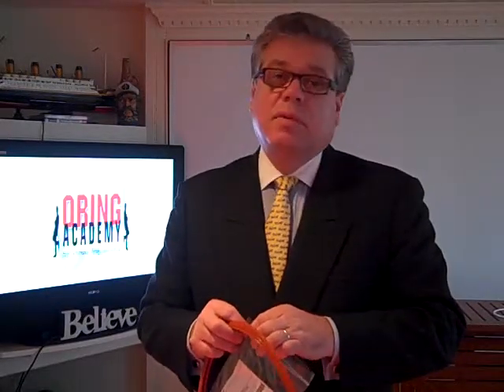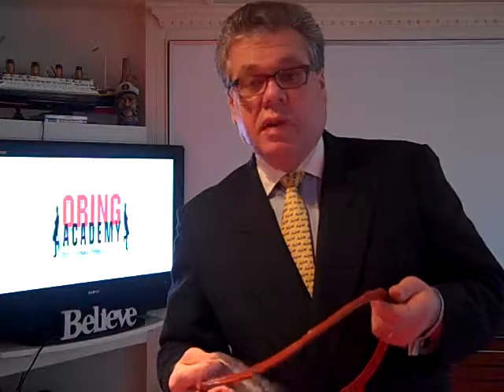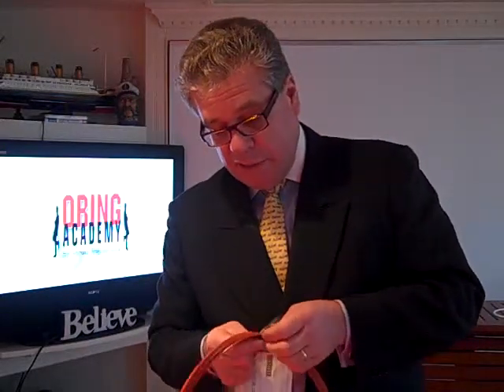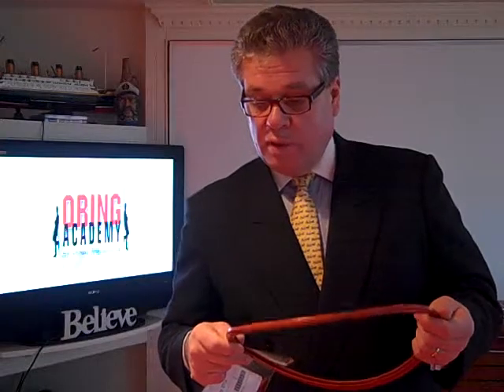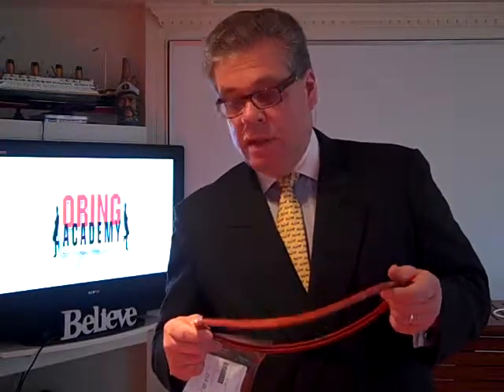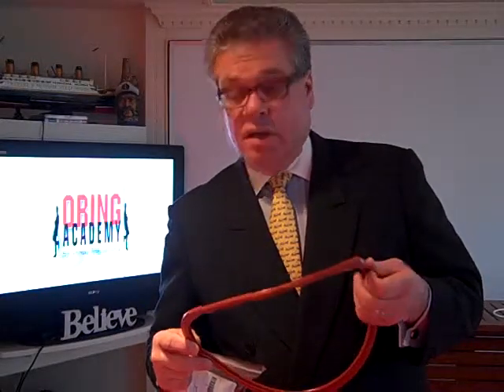Pressure is the big problem with sterilizers. Once you lose the pressure capability, you're not going to sterilize your instruments. I recommend replacing the gasket every six months, because I've seen what happens after you open and close the door many times a day over a period of time — you do lose the ability to seal the chamber, and that is absolutely critical for sterilization of your instruments.